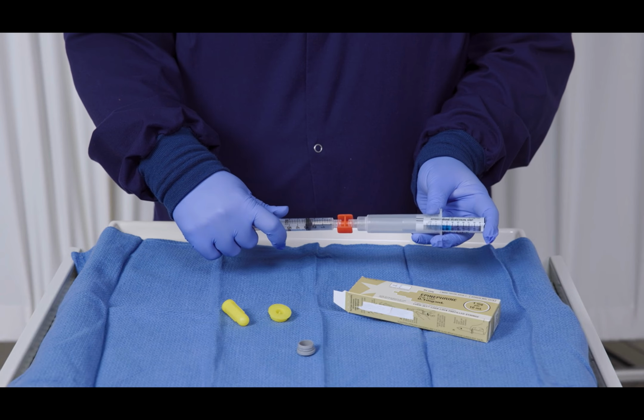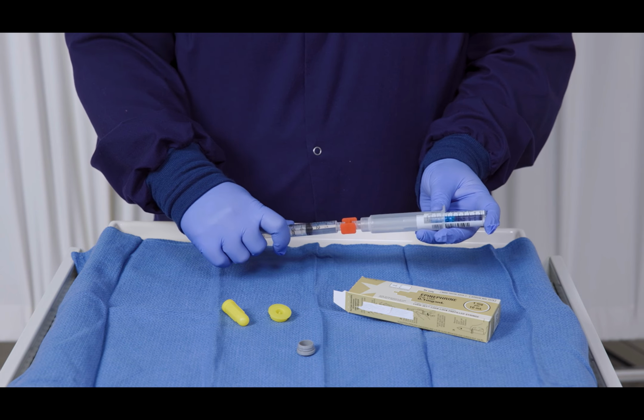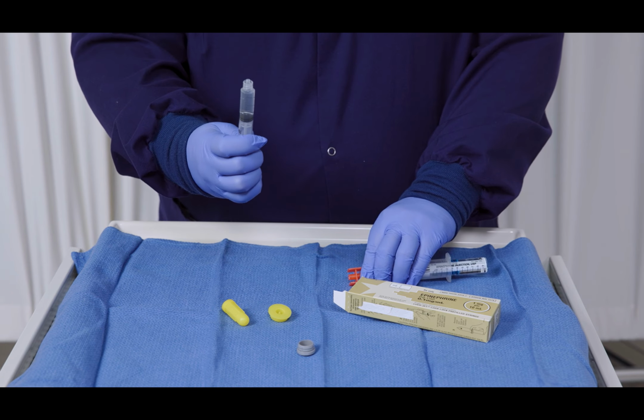Intratracheal epinephrine may be given while IV access is being established. However, the heart rate response may take longer or may not occur. Use a 3 to 5 ml syringe for intratracheal epinephrine and draw it up as previously described.